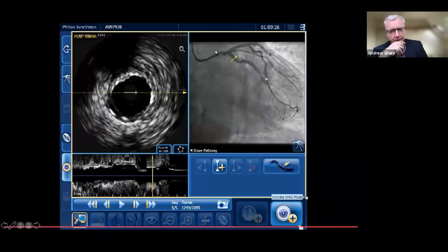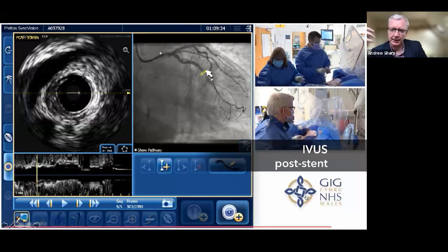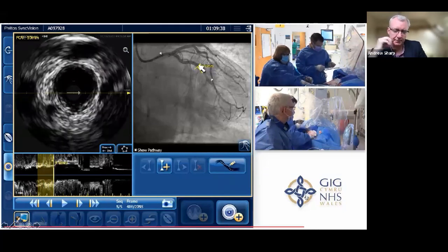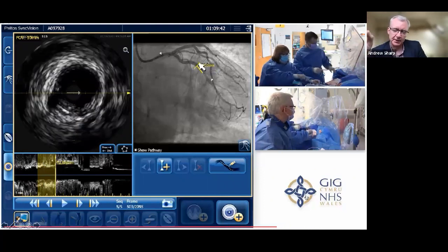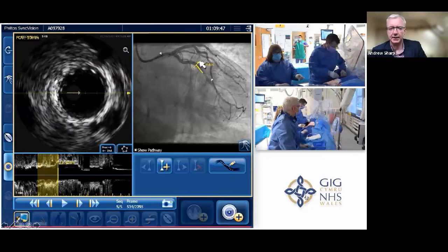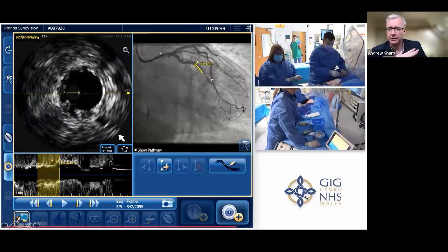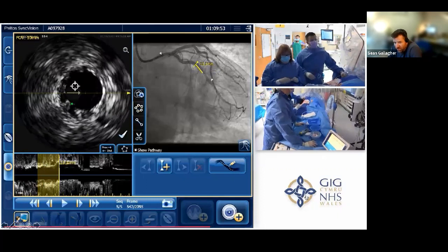Yes. So I think the 3 mm platform will go to about 4.75, depending on which technology, but a 3.5 will typically go a little bit higher to 5.2. So I think that's why we pushed the landing zone a little, which had measured 3.3. We went for 3.5, and then that allowed us to post-dilate up to 5 point something in the left main. And an interesting point in the left main, though, Andrew. Do you think you have to come back to the ostium? No, I don't think we have.